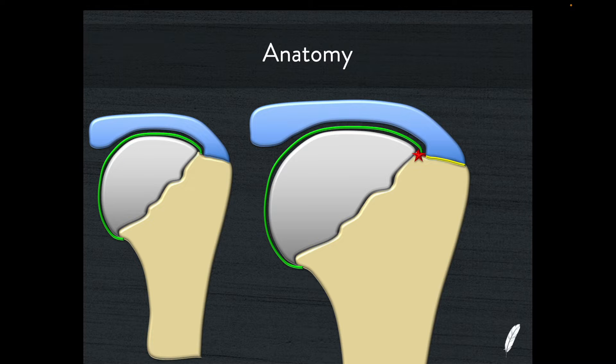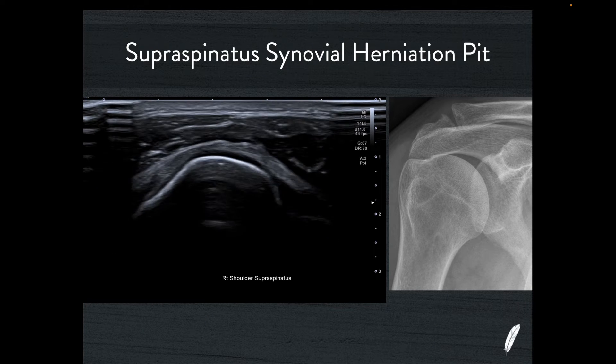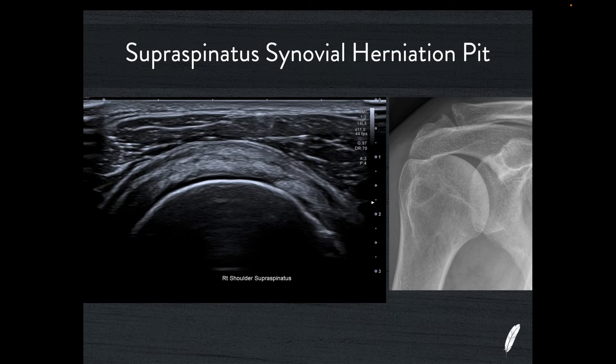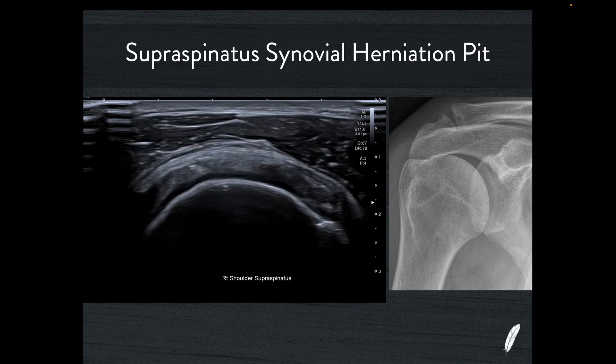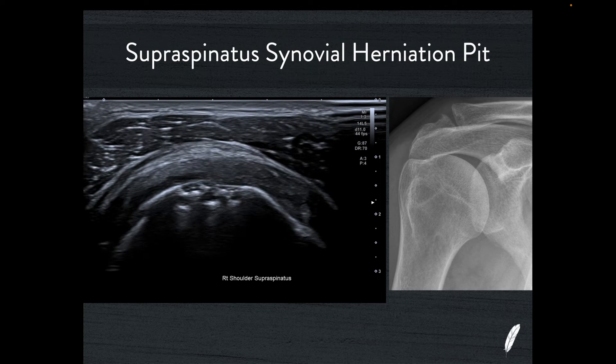Synovial herniation pits are quite normal. We see them all around the body — a lot in the glenohumeral joint, but also in the hip joint and other articulations where a joint capsule attaches onto the skeleton immediately adjacent to hyaline cartilage. If we look at this beautiful transverse view of the supraspinatus tendon, the collagen looks quite pristine, there's nice hyaline cartilage, and then there's quite a broad area of little pitting of the bone in the short axis. That pitting is immediately adjacent to the hyaline cartilage, just at the beginning of the enthesis for the supraspinatus tendon.